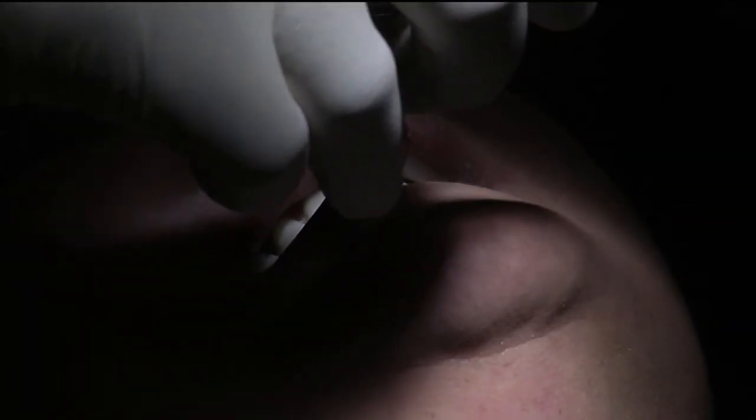Tap up and down, Dina. Dina says she feels a bit high on the right. So keep tapping. Open. Good. And tap again.